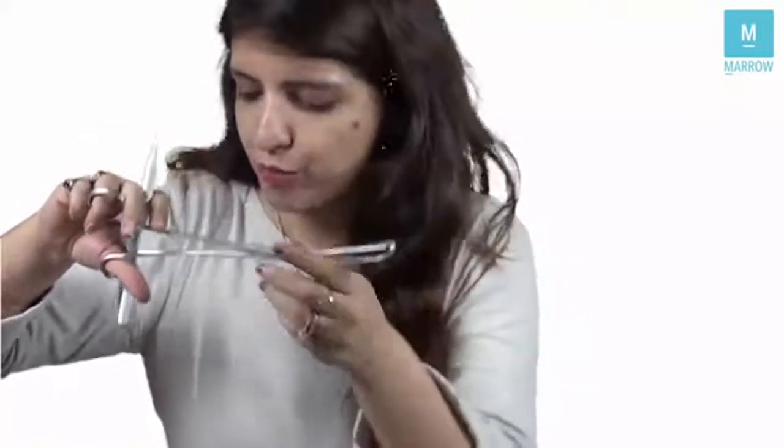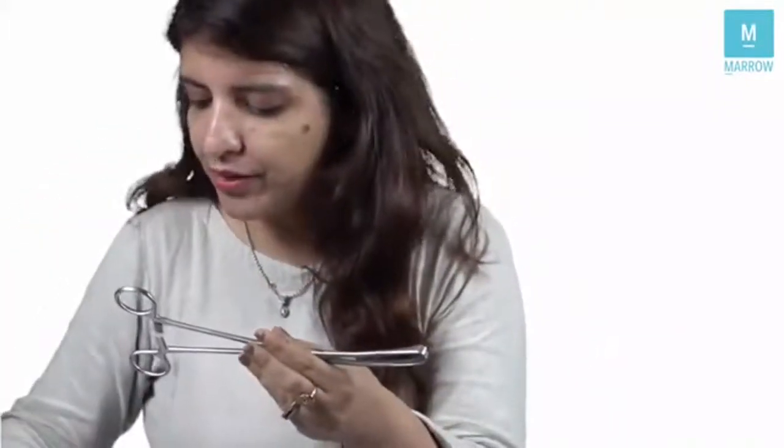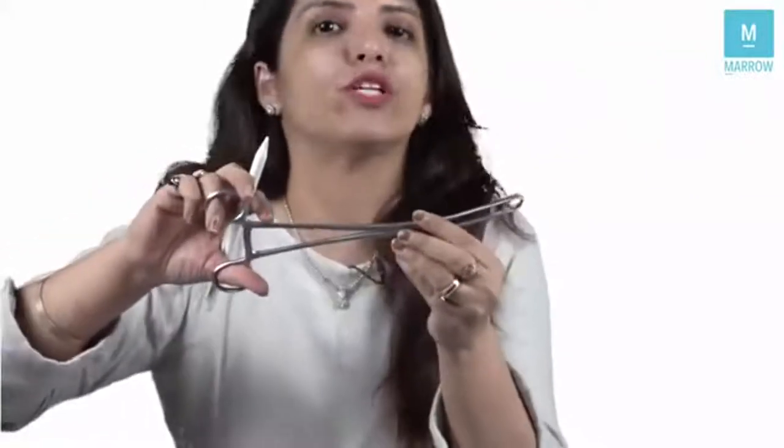So, this is a vulsellum. Again, you have a ratchet lock. Then, at the anterior end, look at the blades. They are curved. That's a concavity which is present there. I'm now going to apply it and show you that when you apply the vulsellum, the concavity should face upwards.